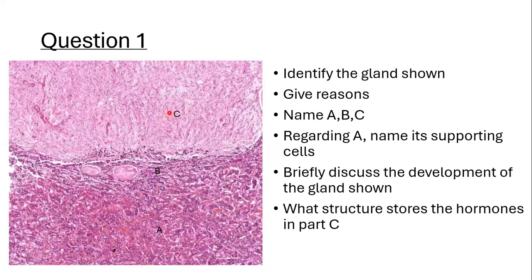Then C would be what? What is the name of C? Pars nervosa. Great. In fact, that is better than saying neurohypophysis. Even if you say neurohypophysis, still good. But neurohypophysis has several parts, namely, remind me the parts of the neurohypophysis. Apart from pars nervosa, which other part? The infundibulum. Okay, the infundibular stalk or the neurostalk.